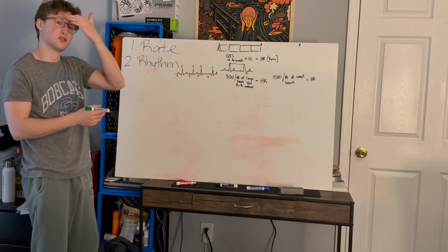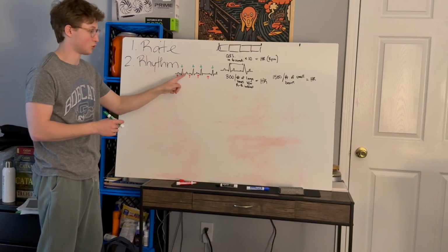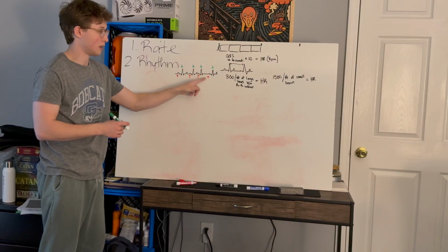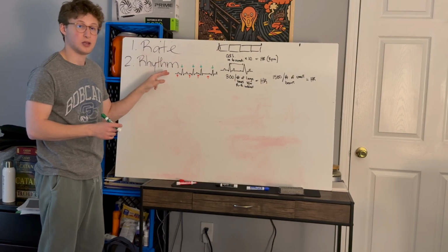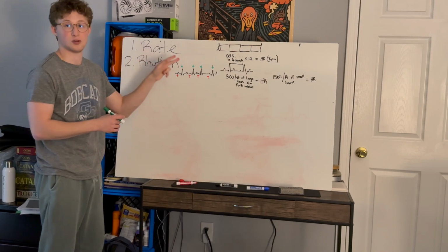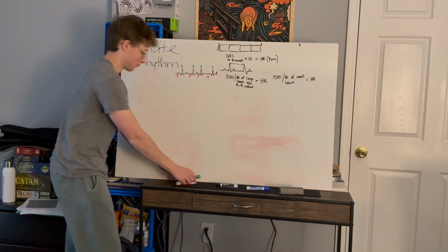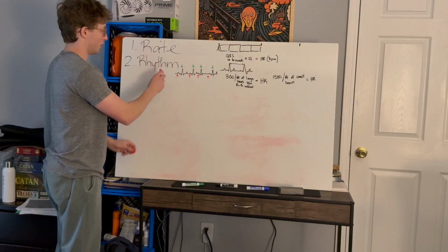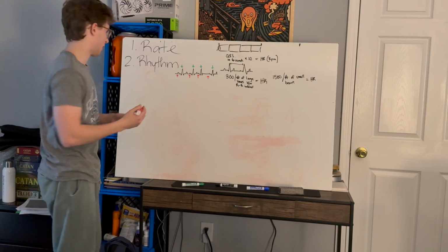So it's important to measure rhythm, and it's important to look at both the rhythm of the atrial contractions and the ventricular. Even if you have both, you still sometimes want to look, because in some arrhythmias, you'll see changes in the timing of one, but not the timing of the other. So rate, rhythm. Next, I like to look at my P waves and my QRS complexes.